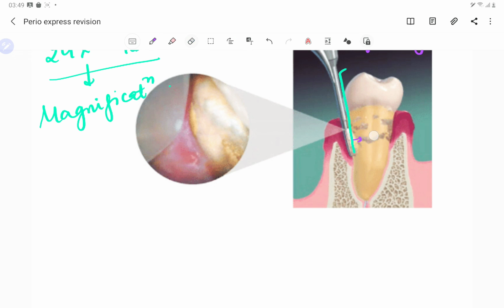I think that is not visible. So this is a 0.99 millimeter diameter fiber optic cable, which is fitted, and it is in fact reusable, so there is no harm in using it. This perioscopic instrumentation gives a clear picture into the subgingival pockets or any furcation.